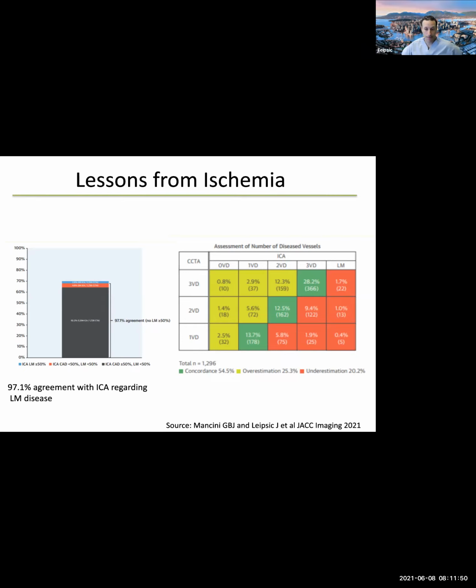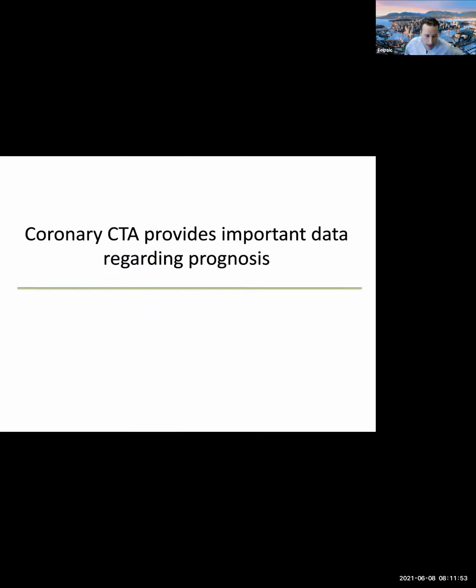was very high. So people will tell me, maybe 15 years ago, I would give this talk and I would really show them these anatomical images. And I'm just a simple radiologist. I would see these images and think to myself, if this doesn't change the way people practice cardiology, I don't know what will. You can suddenly see plaque. You could see a stenosis in the LAD rather than giving someone a post-test likelihood of anatomical disease.